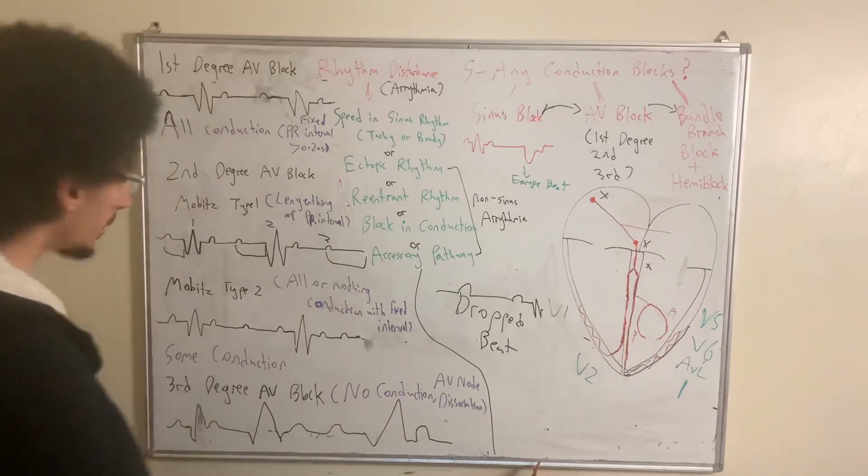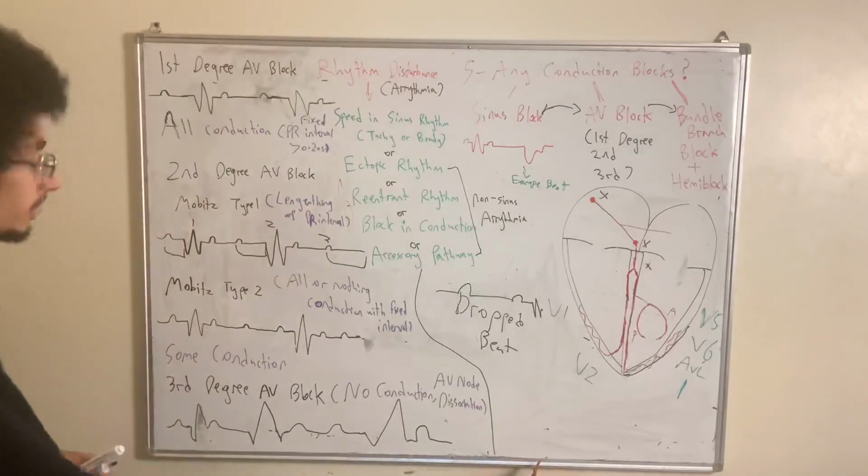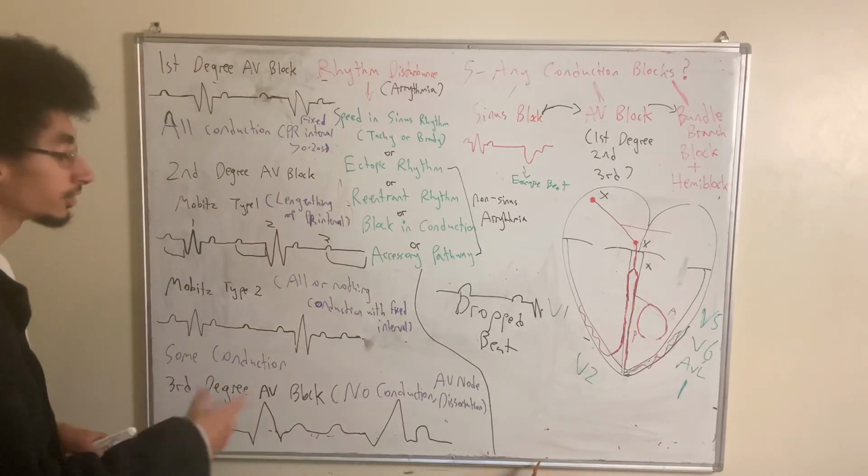Now let's finish the video by talking about third degree AV block, the most severe, the highest degree of severity. Third degree AV block, the worst one.